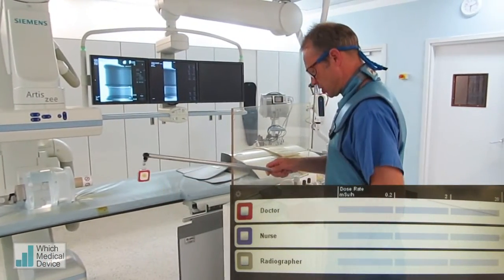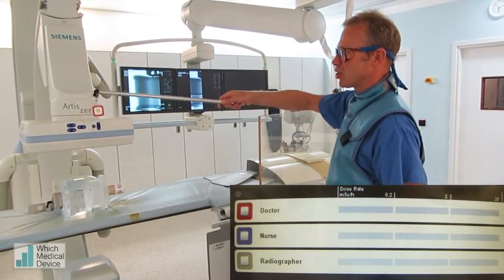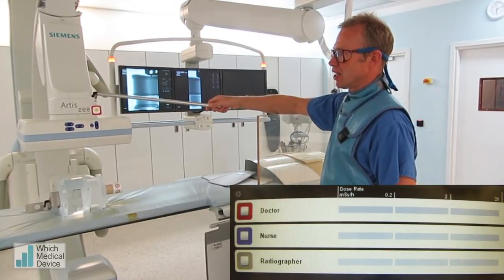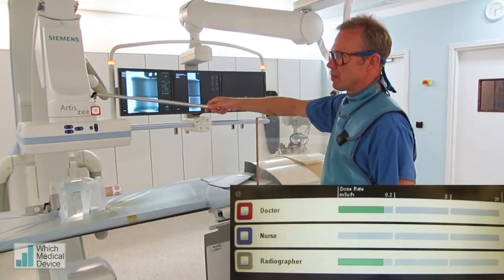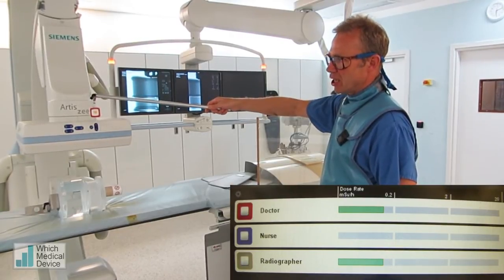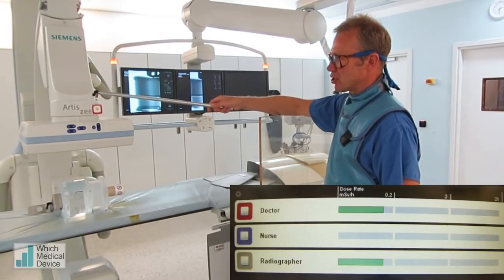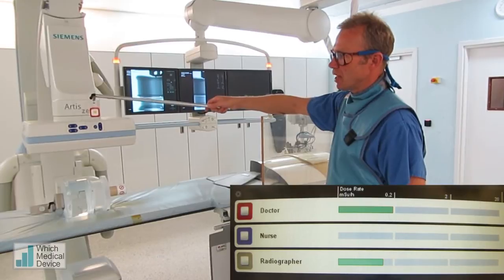We've got this fluoro system set at 7.5 pulses per second, and we're just going to start with the badge up here at about head and neck height. You can see that the dose will vary depending on position — in a green band, then it'll go orange, and then red when your dose gets very high. Up here at 7.5 frames a second, the dose is not too bad.